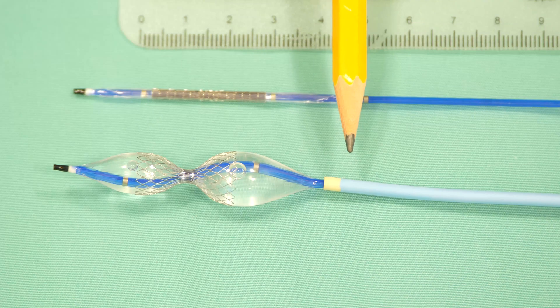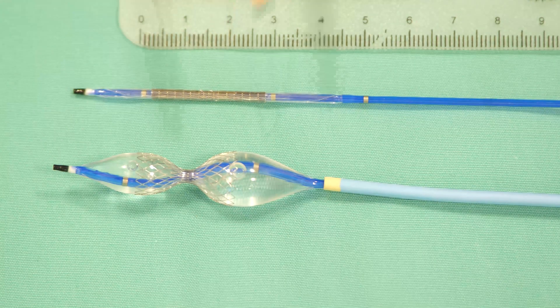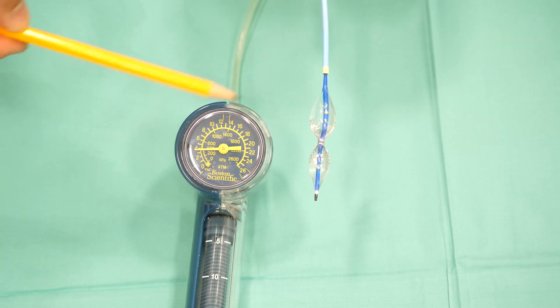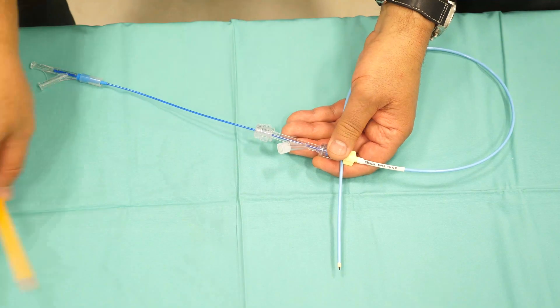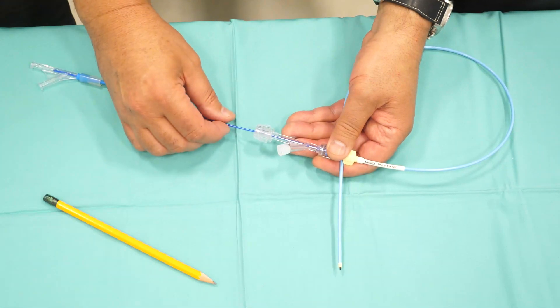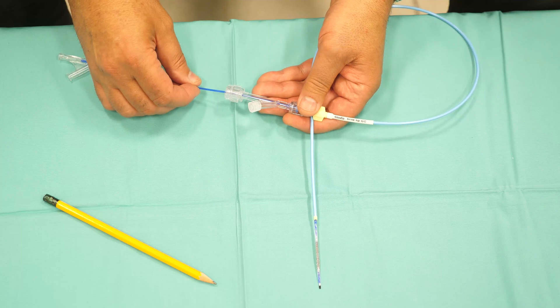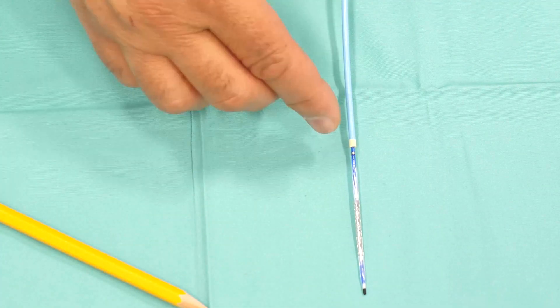The guiding catheter is withdrawn all the way to the most proximal marker, allowing the balloon to reach its final shape. When the reducer is inflated, the length of the reducer is shortened to 22 millimeters. The balloon is inflated to four atmospheres and the reducer gets its final hourglass shape with the center narrowing of exactly three millimeters. When the reducer within the guiding catheter is located at the desired site of implantation, we keep the reducer in place and withdraw the guiding catheter slowly until it reaches the most proximal marker. When the reducer is exposed and properly located at the implantation site, with all three markers outside the guiding catheter, we can inflate the reducer to the proper sizing.